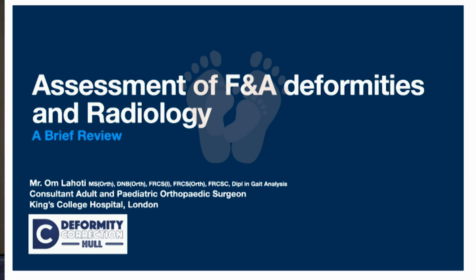Do you mean like where do you bring the C-arm in from? How do you position the patient? Okay. So make sure that the patient is on a radiolucent table and practice that with the radiologist before you drape it. So the X-ray comes from the heel. I'm sure Hemant is going to talk about it, but I can show you later.